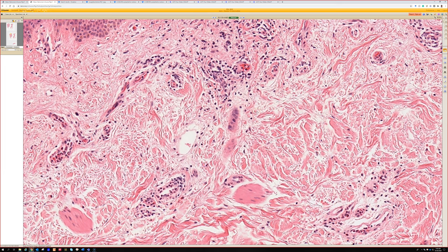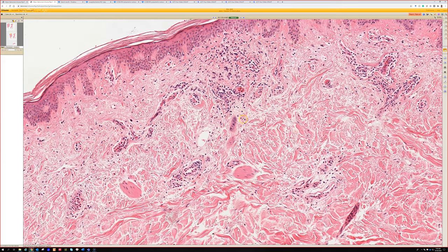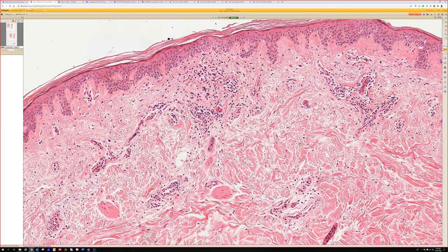There's some thought that there are different categories of urticaria microscopically — some are more lymphocyte predominant and some have neutrophils. I find the neutrophil ones to be easier. Other things I think of when I see this: could this be a dermal hypersensitivity reaction that's really mild? Could this be a bug bite or a drug eruption? Also viral exanthem — these are things that can give you a really sparse, mild, superficial perivascular dermatitis. But scattered eos and neuts are a good clue to push it towards urticaria.